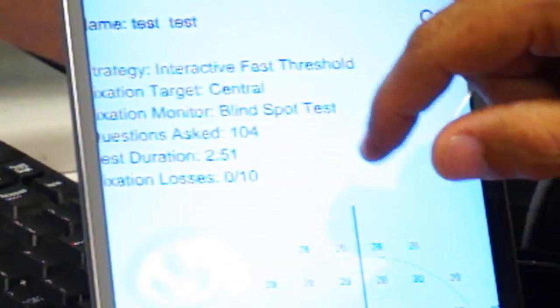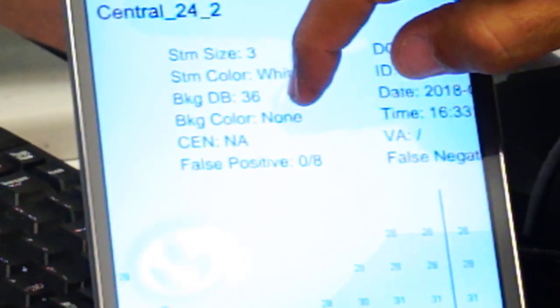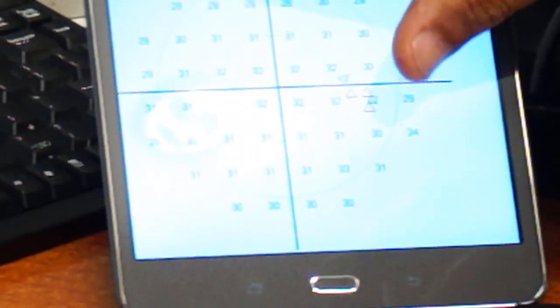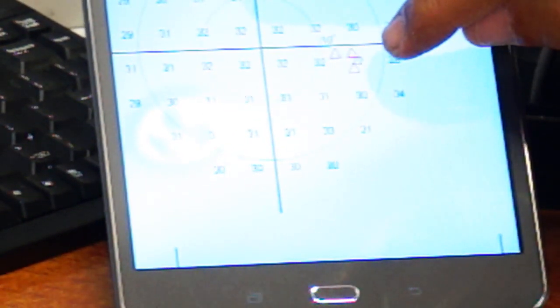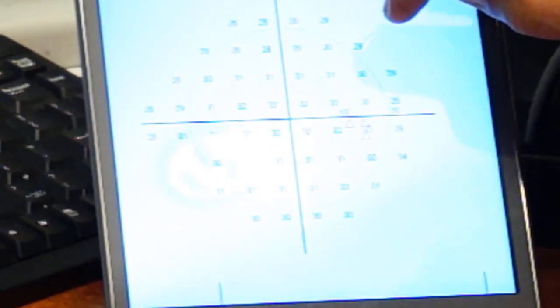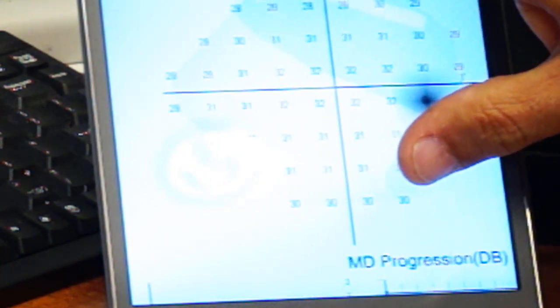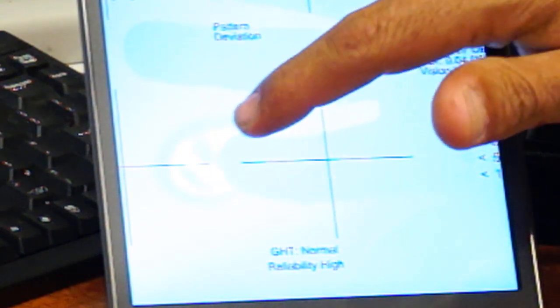Let's look at this report. It took 2 minutes and 51 seconds to complete the threshold test. We have the usual monitoring parameters such as fixation loss, which was 0 over 10, as well as false positive and false negative. Fixation is monitored by blind spot testing — the triangles indicate the location of the blind spot tested, and the numbers indicate the sensitivity at each location. There is a grayscale map, a total deviation map, and a pattern deviation map with probability maps shown below.